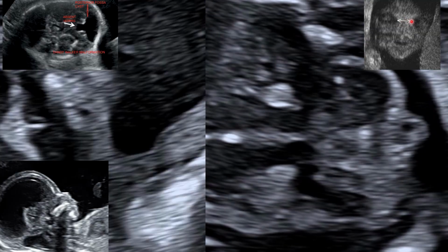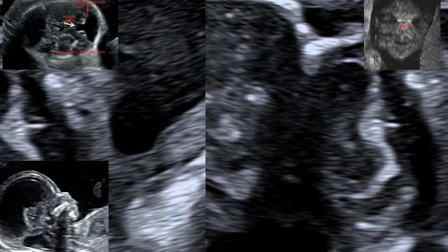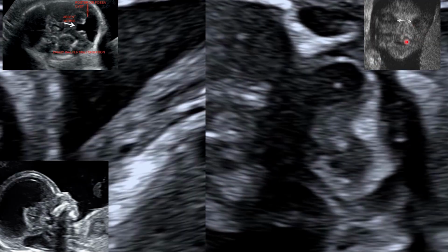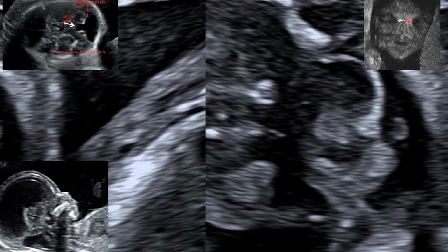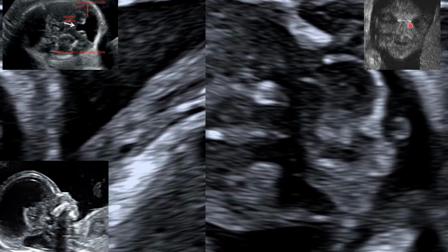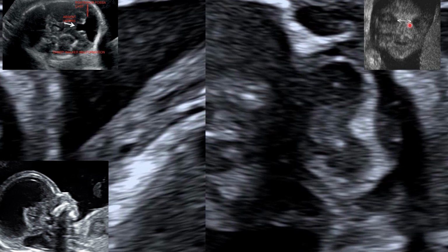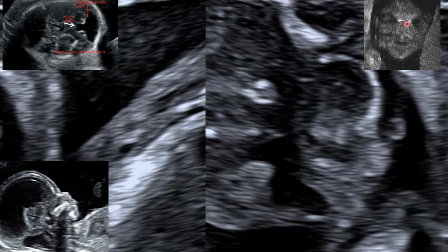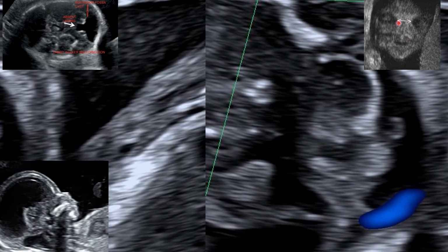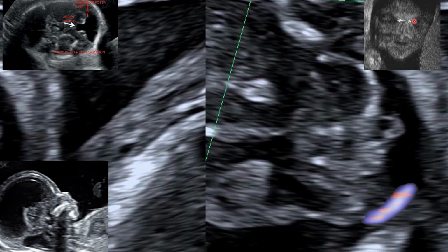I hope you are following. This is very critical. We are screening for hypertelorism, hypotelorism, and Dandy-Walker malformation. If the interorbital distance is less than 9 millimeters, the fetus is likely to have hypotelorism. If you do the correct measurement and it's above 21 millimeters, then that is hypertelorism. You must be careful so that you don't miss these conditions when you're doing your anomaly or detailed scan in the second trimester.